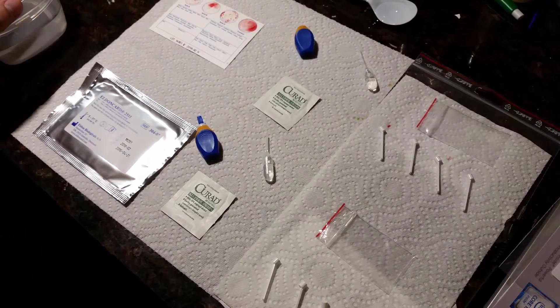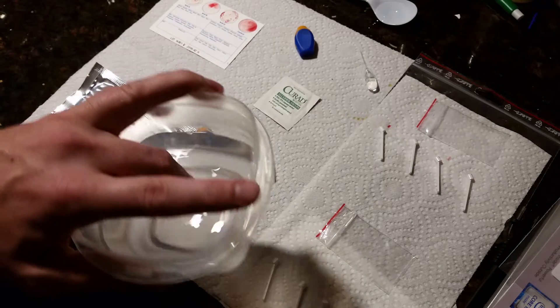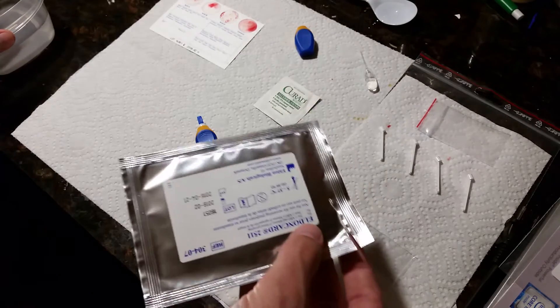As I was saying, I'm a nurse so I like to have really good data, so I'm doing it again. My finger is soaking over here in this somewhat warm water and I've got the kit basically open already.